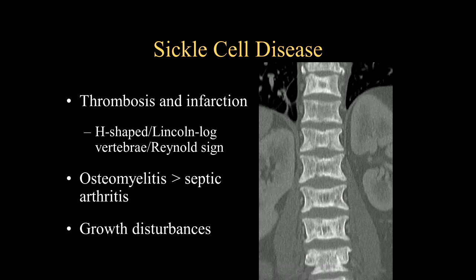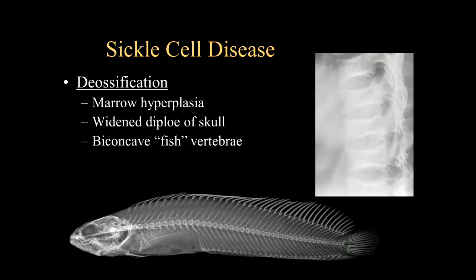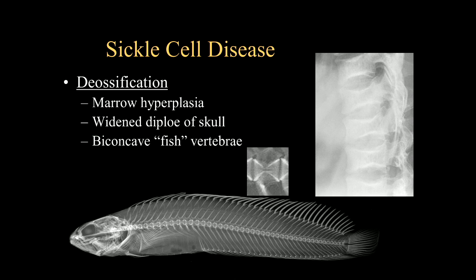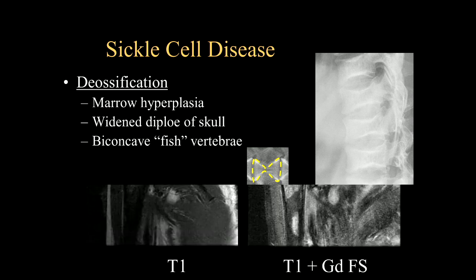Growth disturbances have also been mentioned. On CT of the sickle cell patient, you see the classic end plate compression fractures right in the central portion of the vertebral end plates, and overall sclerosis with coarsening of the trabeculae due to the abnormal marrow. With that packing of the cells, you can have deossification where there's marrow hyperplasia, widening of the skull. This case shows fish vertebrae — the smooth indentation compression fractures. Looking at the radiograph of the salmon, this is what we're referring to as fish vertebrae with that biconcave shape. Fish mouth and codfish are also synonyms.